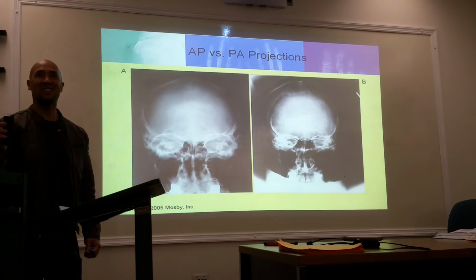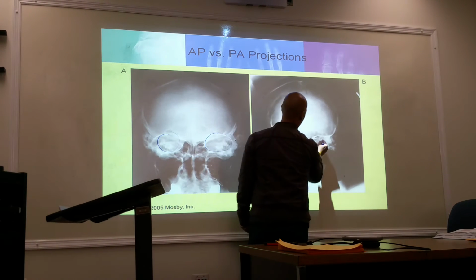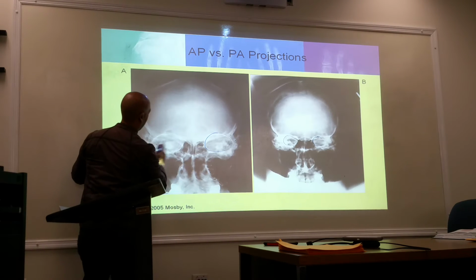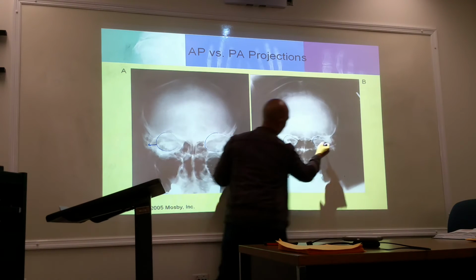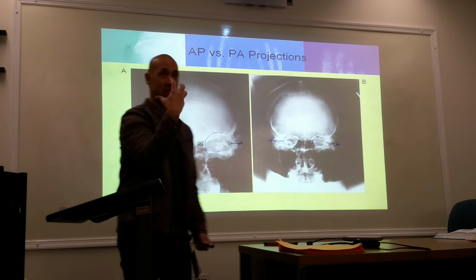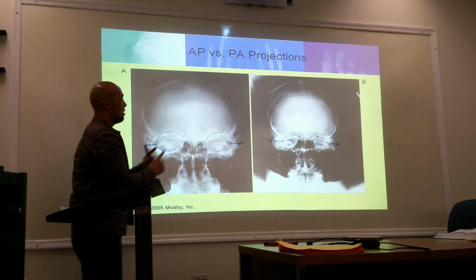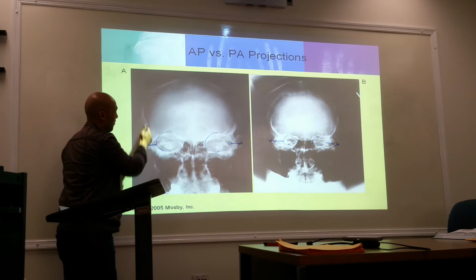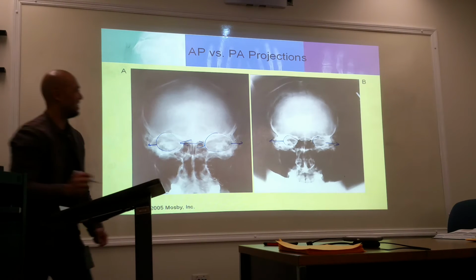Somebody just said sockets. Who said socket? Don't look at bigger. We're not looking at bigger. Look at the distance from the outer edge to the outer edge. Yes, they are bigger, but if you are AP, you said the sockets were going to get magnified, right? So the sockets do get magnified, which means that because they're magnified, they're going to be further away, closer to the edge of the outer margin. Also further away, and these are closer.